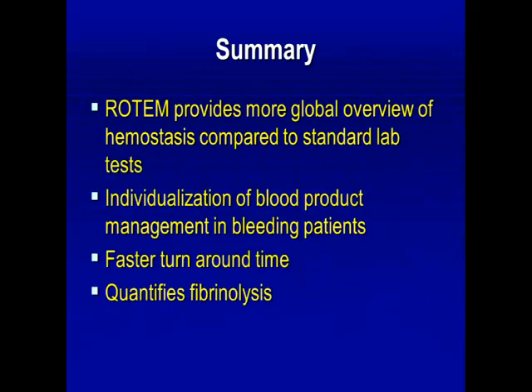Because I have to say that, if you've got a borderline INR in the OR for a patient who might be oozing slightly and the surgeons aren't sure what's happening, you end up in those cases almost always just sort of giving some FFP to see what's happening. But in this case, you can individualize based on what you see.